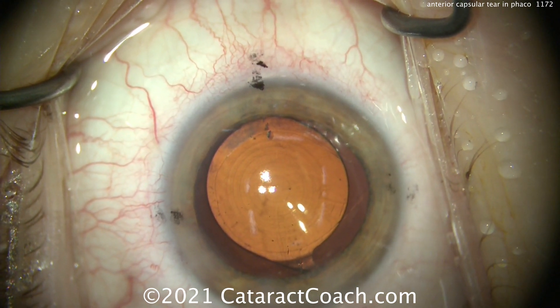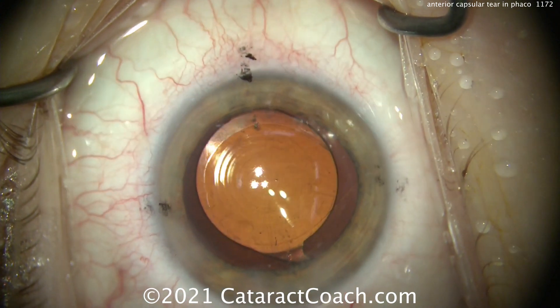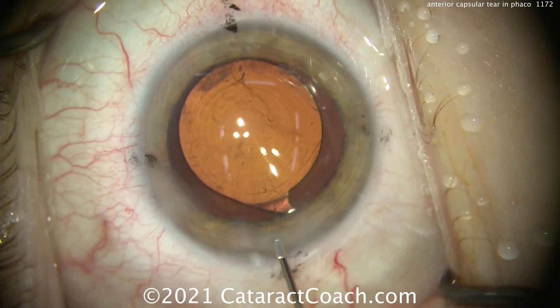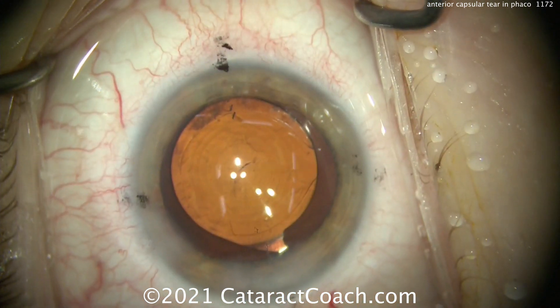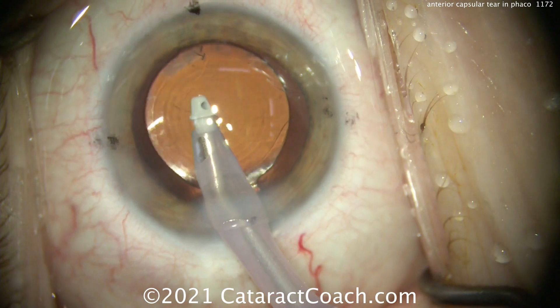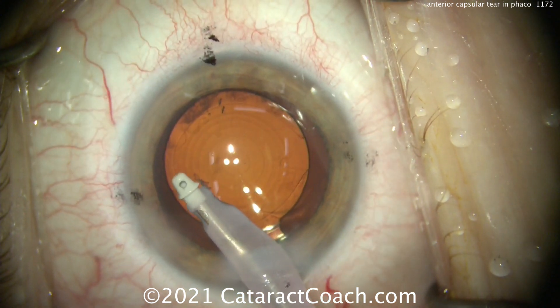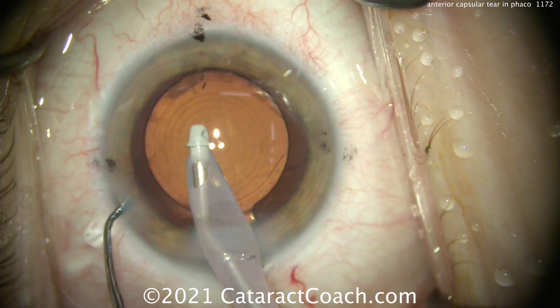That looks pretty good. Now what should we do next? We're going to take out the viscoelastic, but maybe we should try to seal up this incision first to make it a little bit more watertight. So using BSS on cannula, let's try to seal up this incision — so that when I take the IA probe out of the eye, we're not going to allow the AC to collapse. We want to keep AC stability going on here, not a lot of motion. Now slowly taking out the viscoelastic. What have we done differently on our settings? Drop the flow rate — instead of 60 cc's a minute, we've done 30 cc's a minute. Drop the infusion pressure a little bit. You can still keep the high vacuum.